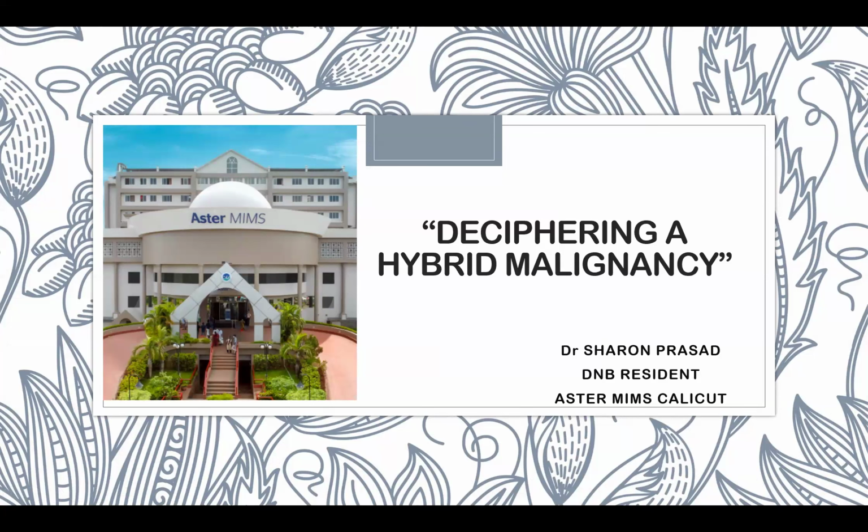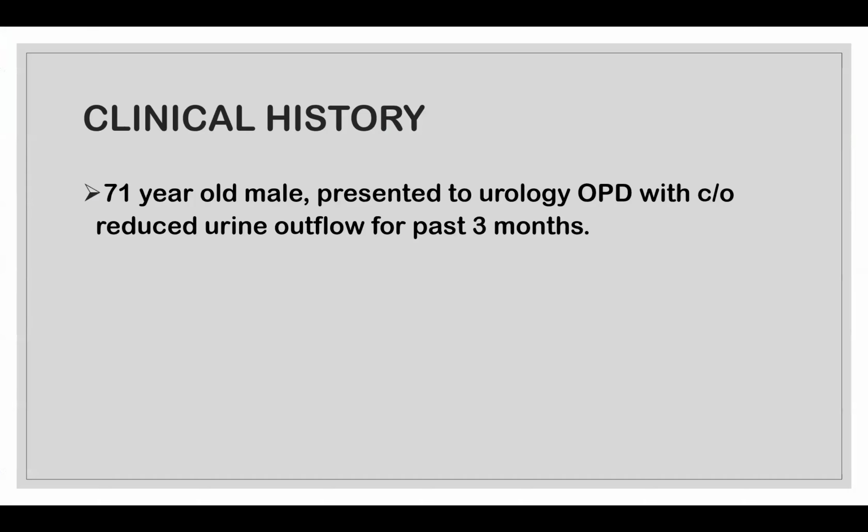Good afternoon, all. I am Dr. Sharon Prasad, DNB resident from Aster MIMS, Calicut, presenting a hybrid malignancy. The clinical history: a 71-year-old male presented to urology OPD with complaints of reduced urine outflow for the past 3 months.